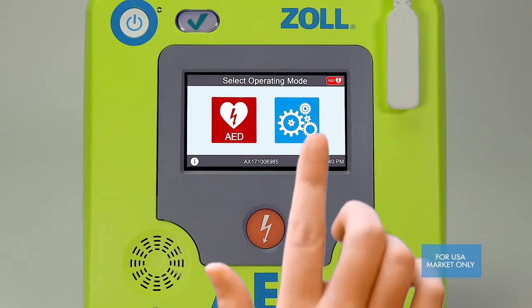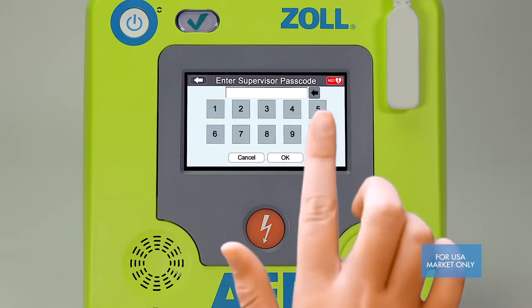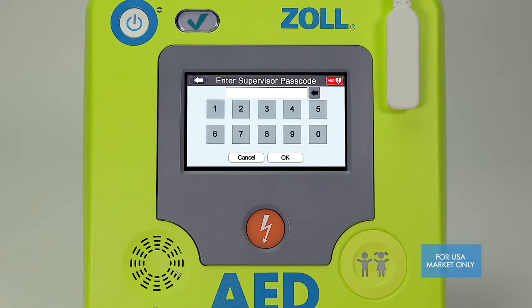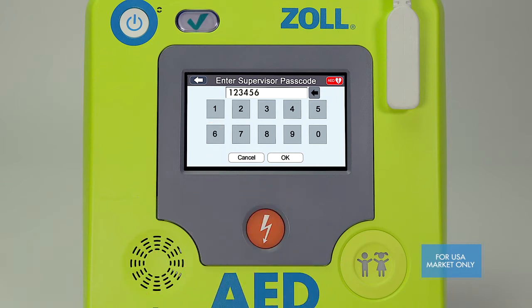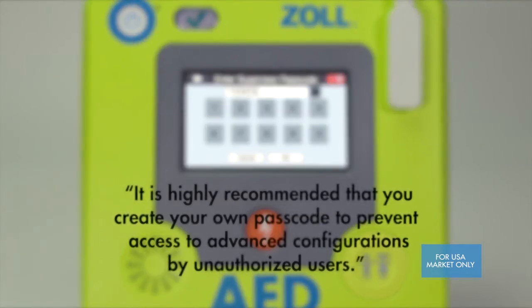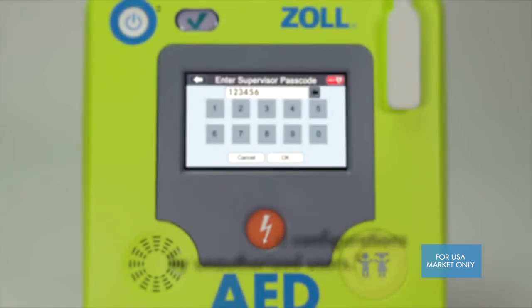Selecting the blue gear icon will open the basic configuration screen. In this screen you will see four icons. The last icon is the locking feature that allows only authorized users to access the advanced configuration features of the AED. Press the yellow lock icon and enter the passcode. The default passcode on a new Xole AED3 is 123456. You can create your own passcode in the advanced configuration settings, which we will cover later in this video.